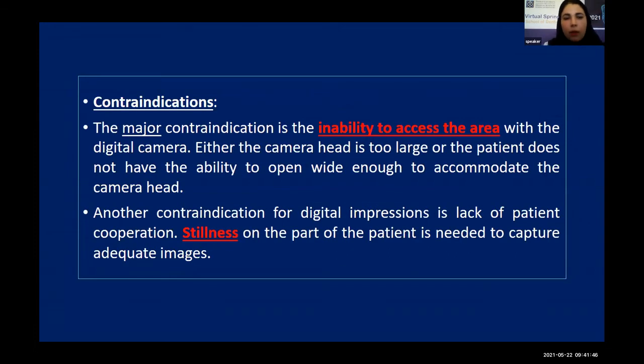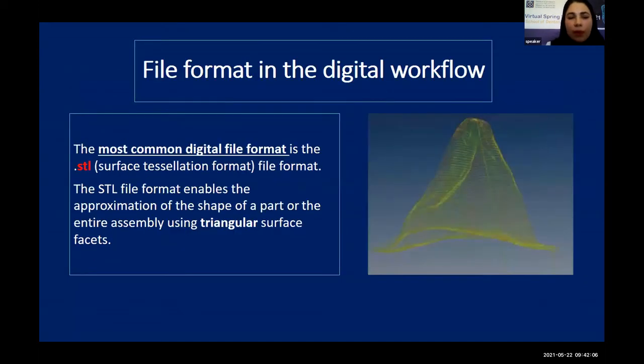This technique has some contraindications. The major contraindication is inability to access the area. Another contraindication is lack of patient cooperation. So stillness is essential. After making the digital impression, the file format in digital workflow will be noticed. Actually, the most common digital file format is STL, which stands for Surface Tessellation Format.